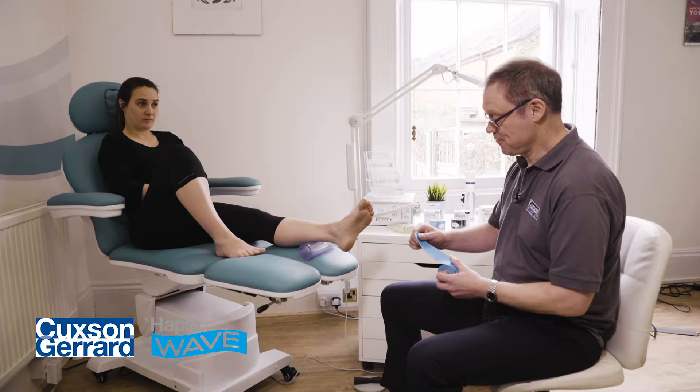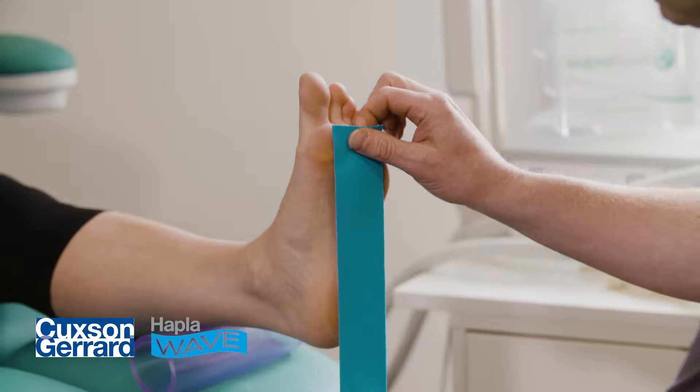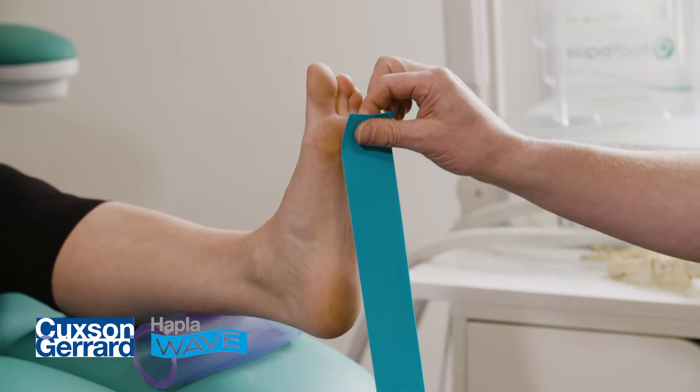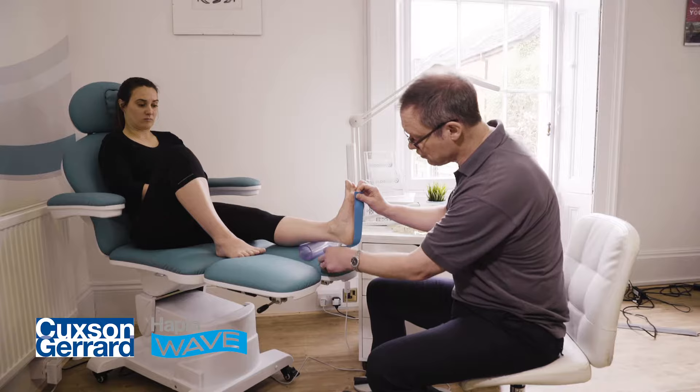Let's measure how much we need first. We just dorsiflex the foot slightly. We're going to lay the distal portion of this tape just over the central metatarsal heads. It's going to travel along the plantar aspect of the foot, plantar aspect of the heel, posterior aspect of the heel, along the Achilles tendon, up to really the myotendinous junction where the Achilles tendon appears from Soleus and Gastrocnemius. Because this tape is so stretchy, it might seem we need quite a lot, but we don't — we're going to stretch it. So this will probably reach to about the mid portion of the Achilles tendon, which will be sufficient for the first piece.